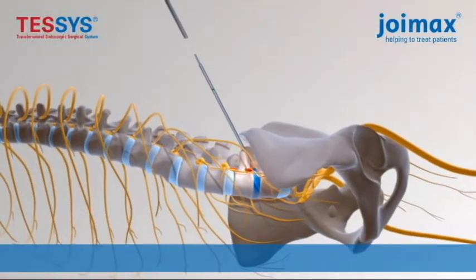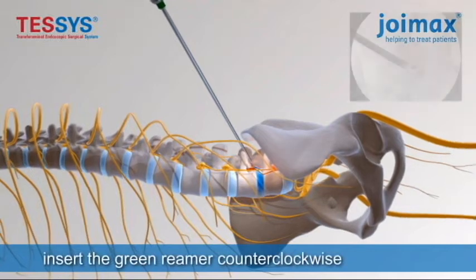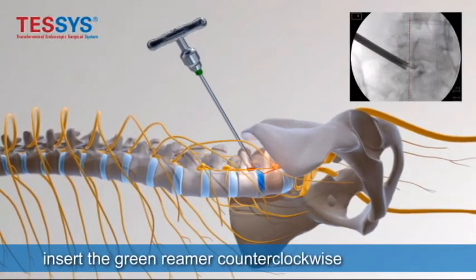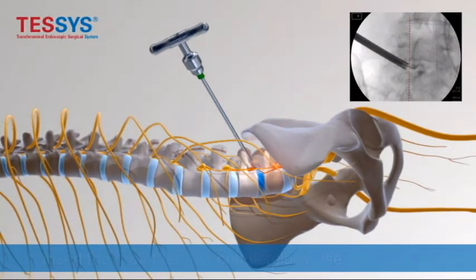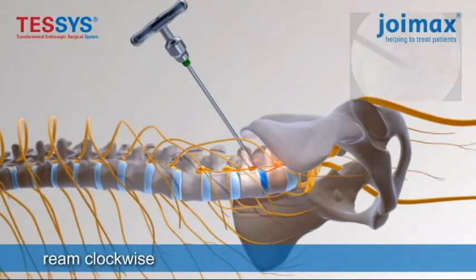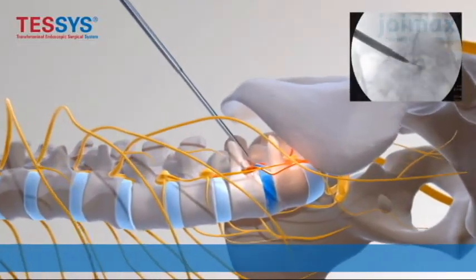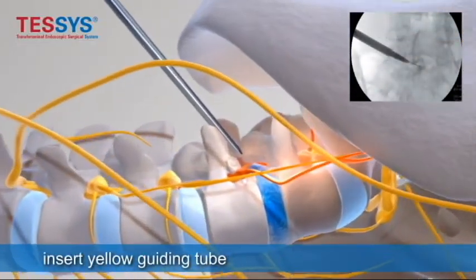Then the sequential dilators are placed over the guide wire. Once you dilate it, you start to ream with the reamers. There are three reamers with different sizes increasing in diameter. Now going down to the spine, you can see the superior articulating process which is being reamed with the reamer.